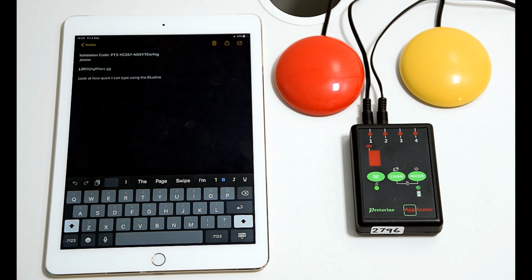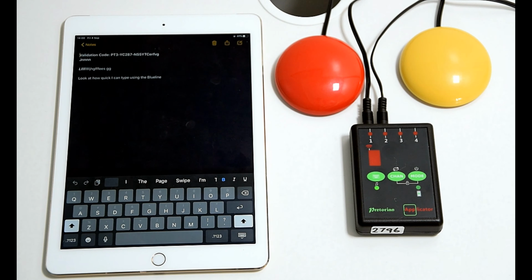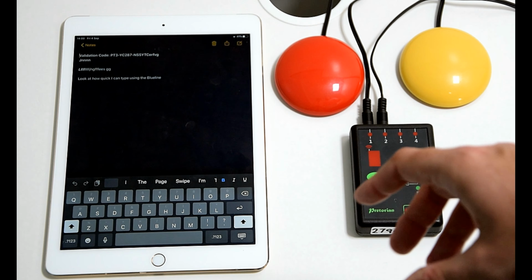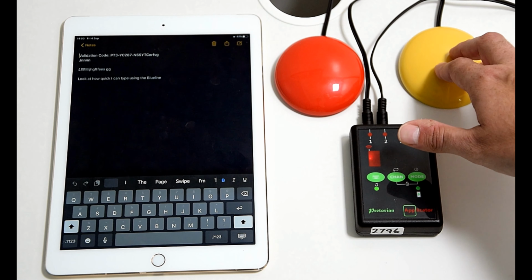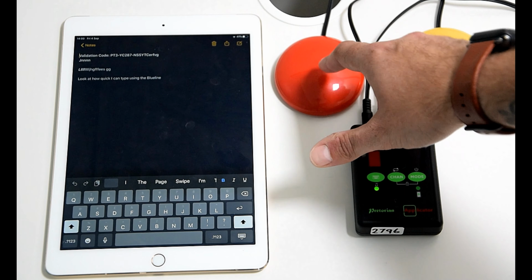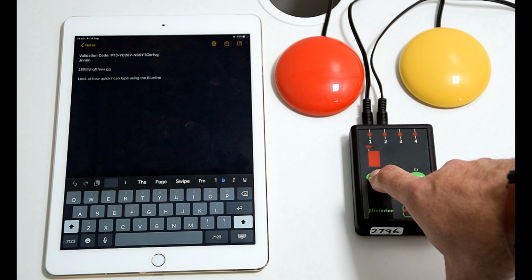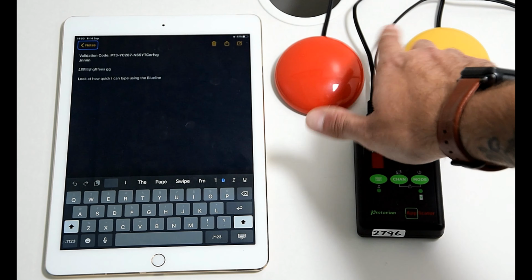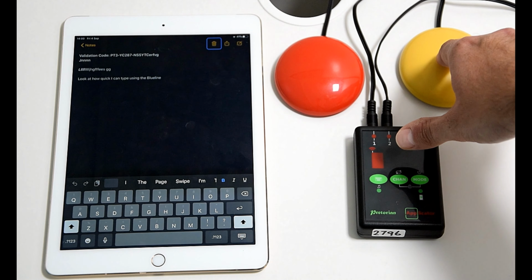that's the song that we have playing in the background. Now, as I say, you can carry on using it as normal and use the device as normal as you would. You can skip it forward to a different song and pause it again. And then at any point, if you just want to come out of that mode, your settings are still set up to scan along and carry on using your iPad as normal.